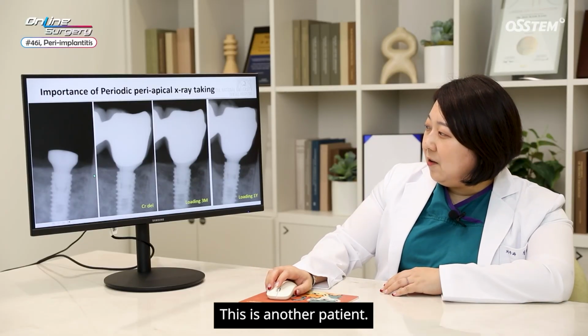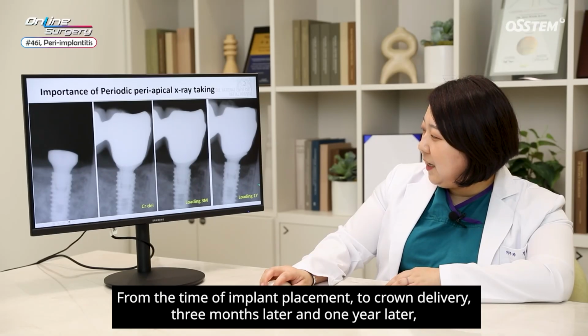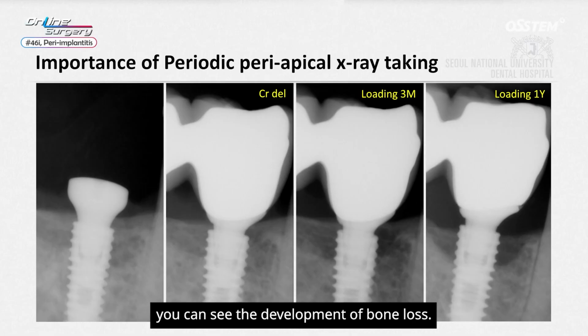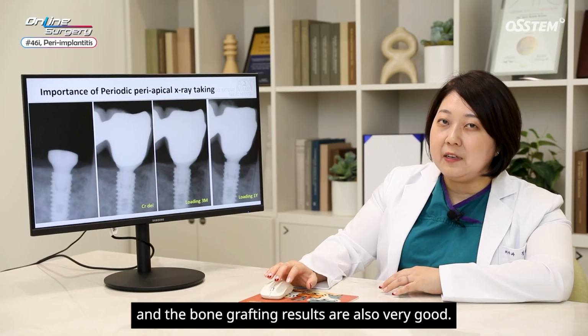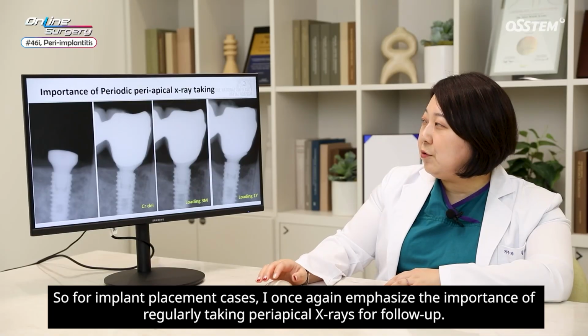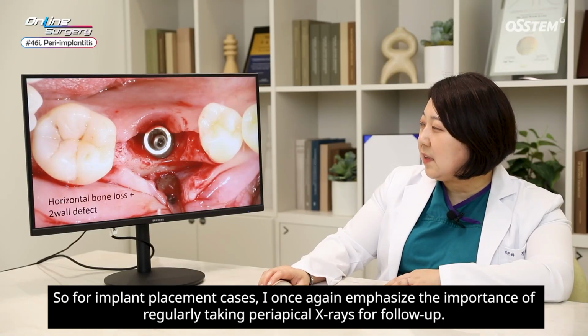This is another patient. From the time of implant placement to crown delivery, 3 months later and 1 year later, you can see the development of bone loss. Usually, it is a 3-wall or 4-wall defect, and the bone grafting results are also very good. So for implant placement cases, I once again emphasize the importance of regularly taking periapical x-rays for follow-up.